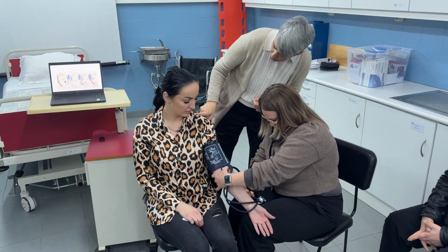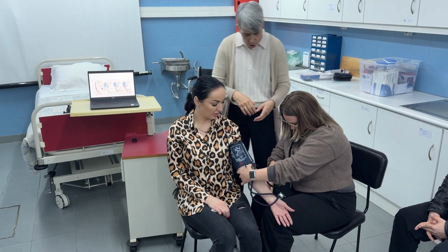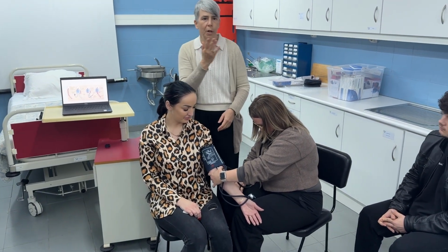Do you know your blood pressure? Not really. It's a bit low. A bit low, so we will go up to 180 or 190.